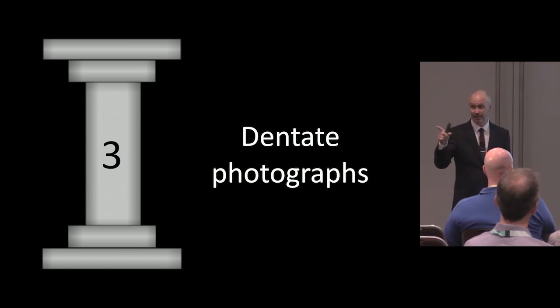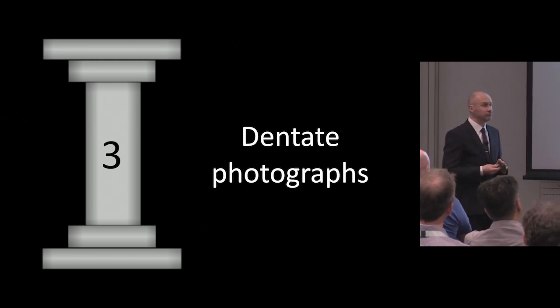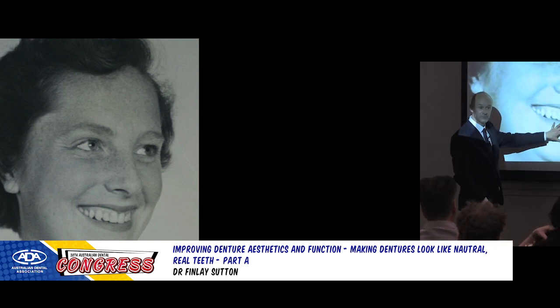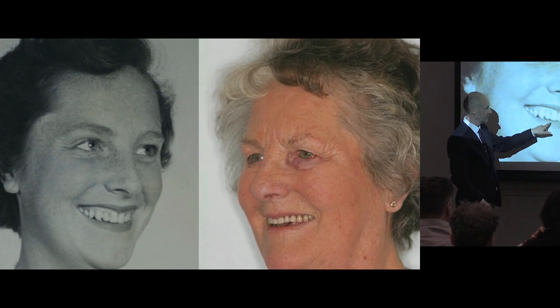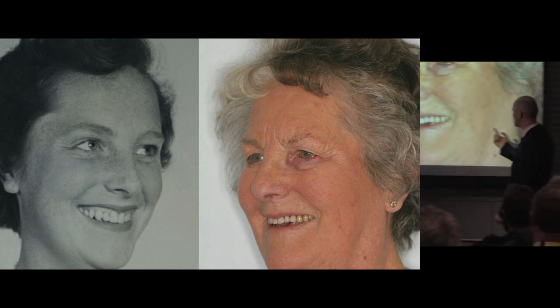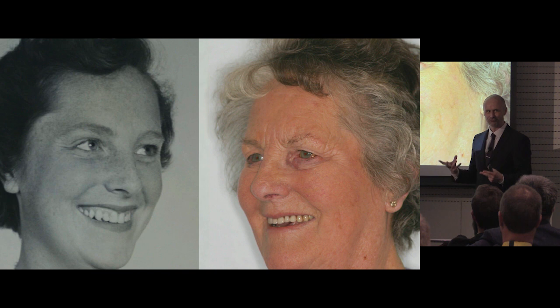We're going clinical now. This is the exciting bit. So, in order to produce really lovely looking, particularly complete dentures, it's just crucial to have a lovely photograph like this, a dentate picture. This is brilliant. And more people have these photos available, and they can actually find them. And then this is Muriel here with a British standard denture with these little tiny teeth set on the ridge, back. It just looks wrong.